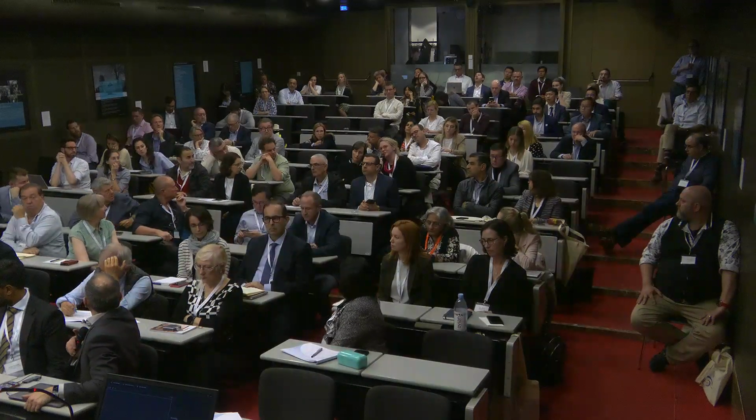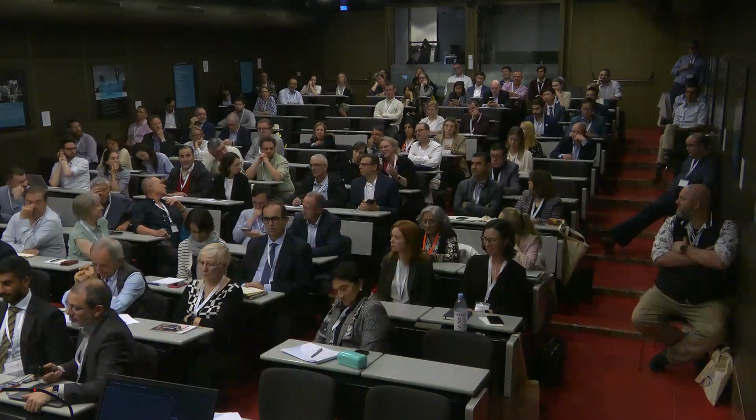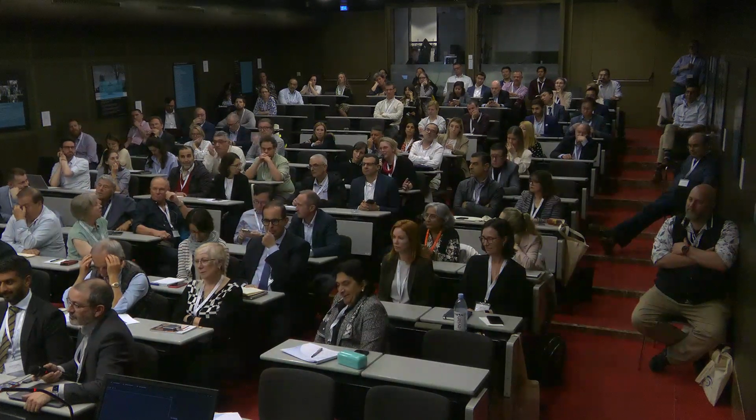Rebecca Burgell, Melbourne, Australia. Do you think there's going to be a time where we just do the provocation tests? We are testing function here, and very few people eat lying down and with 5 mil. So the thing we care about is how they eat.